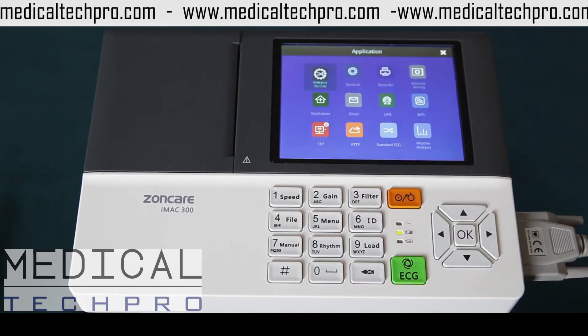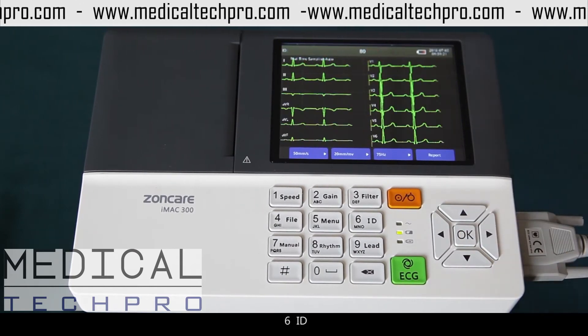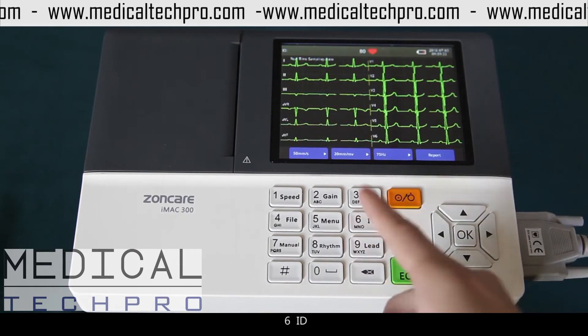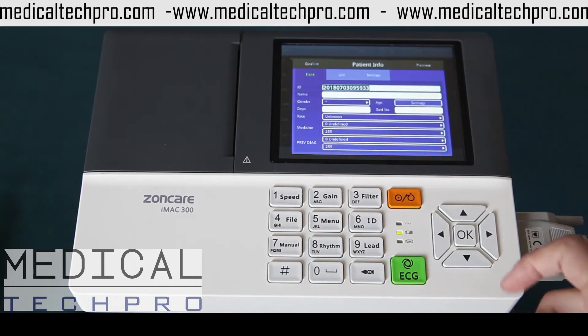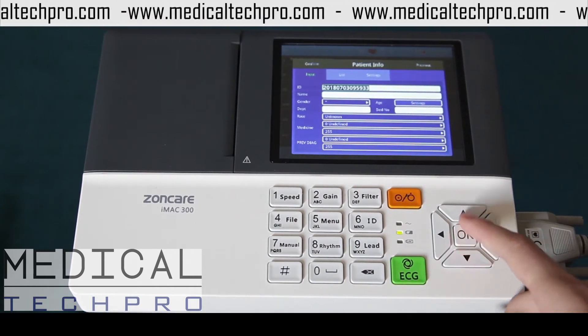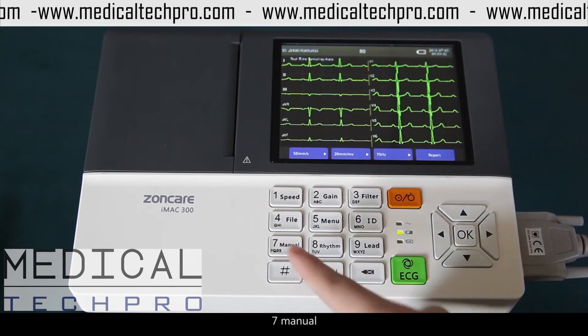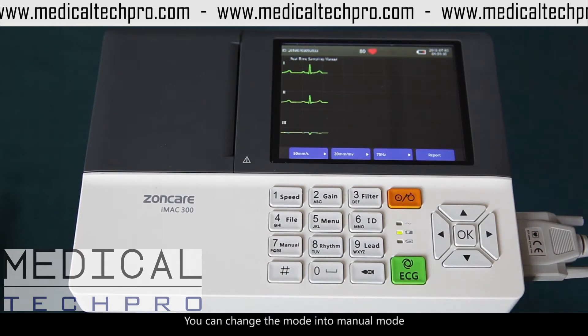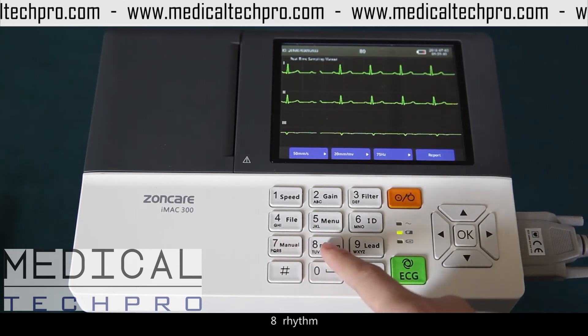5. Menu. 6. ID — patient information. 7. Menu — you can choose the mode into menu mode. 8. Rhythm.